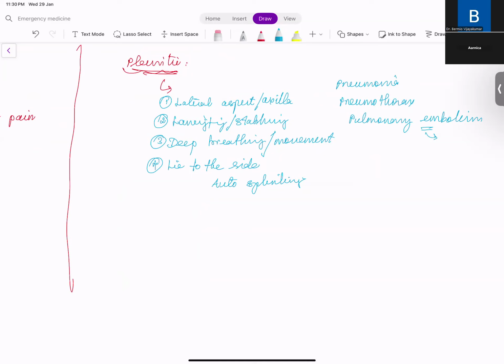Just by chest pain, they do an ECG. There may be some minor abnormalities like a T-wave inversion or a mild ST elevation not satisfying the criteria. They refer immediately to a higher center, even without anything, telling that it is an MI. So that may not be ideal. If you are very clear about the ECG findings, what to specifically look for, whether it is an anginal or a non-anginal type of chest pain, we can reduce that stress for ourselves and for the patient.